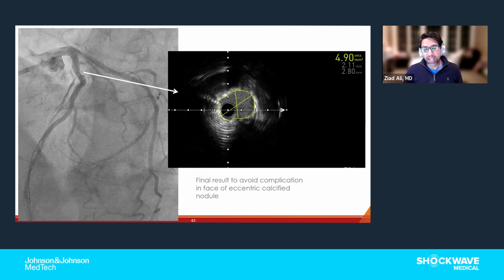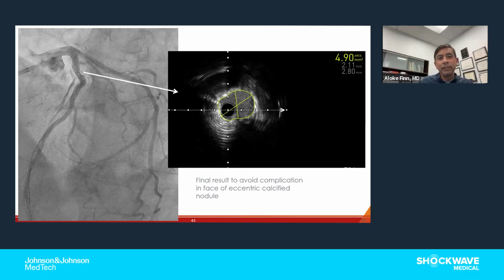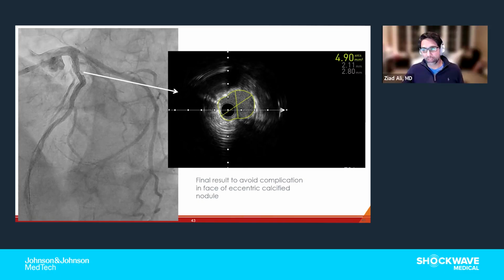And so I think in this situation, as also was shown in the beautiful example that Alok showed in the calcified nodules, you're changing the compliance, because if you have one break in your windshield versus 100 breaks in your windshield, it will definitely change the compliance. This is all theory, but I think, at least from my point of view, you had little downside if you could deliver the IVL balloon to try and create some more fractures. But we don't know whether it could have improved it.